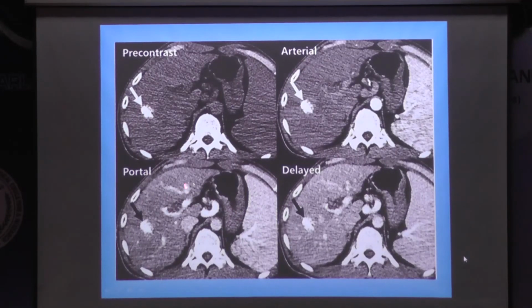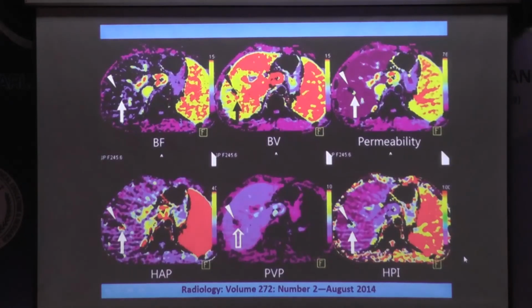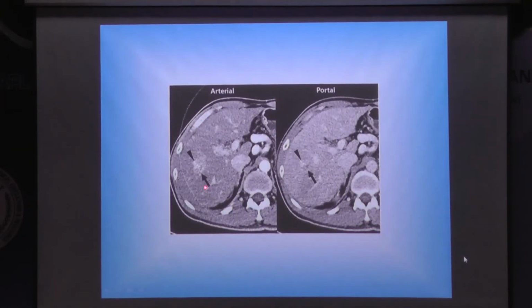This is a case to illustrate the importance of perfusion imaging, where the hepatoma has been embolized using lipiodol. This looks normal. There is no abnormal tumor, that is, no residual tumor, seen. But in perfusion imaging, you can see that there is a small area of arterial hypervascularity. They followed it up 1 month later, did a CT, and you can see that there is a recurrence there. So you can see how important perfusion imaging is, and it has a lot of future in hepatic vascular imaging.